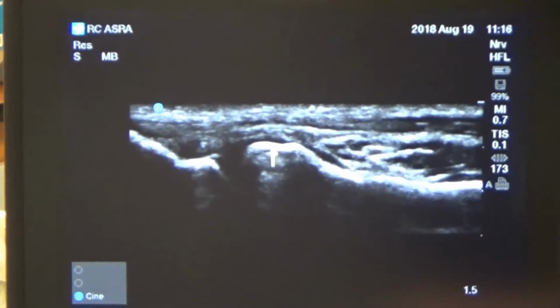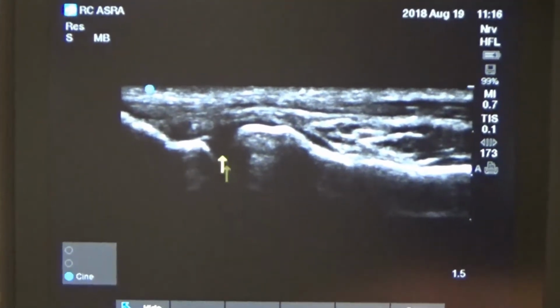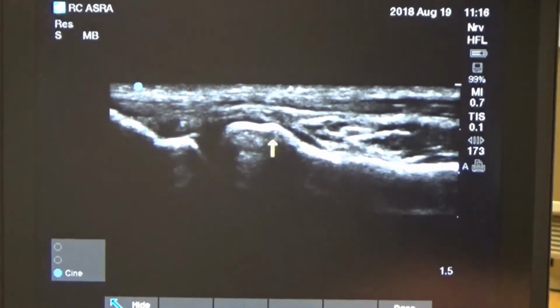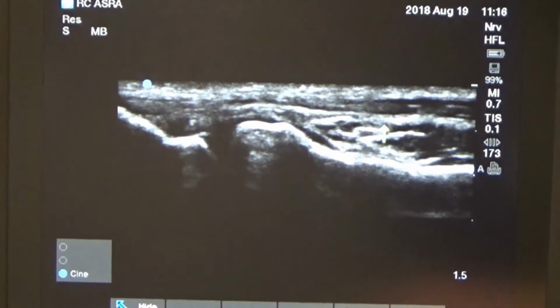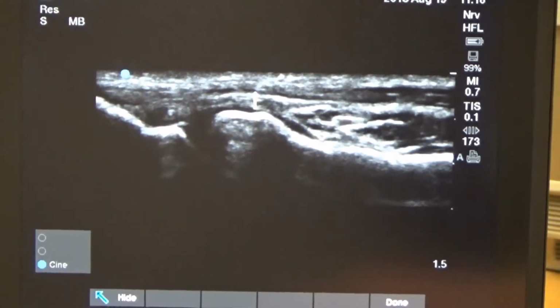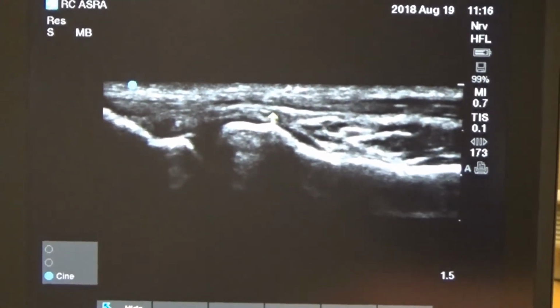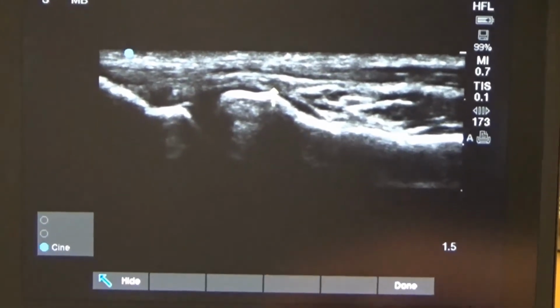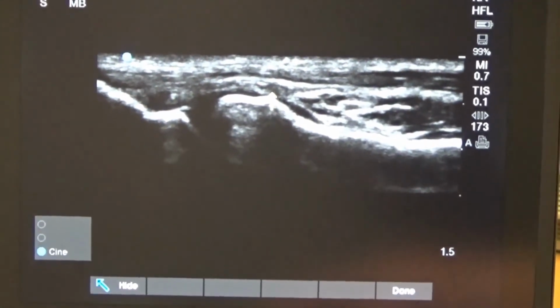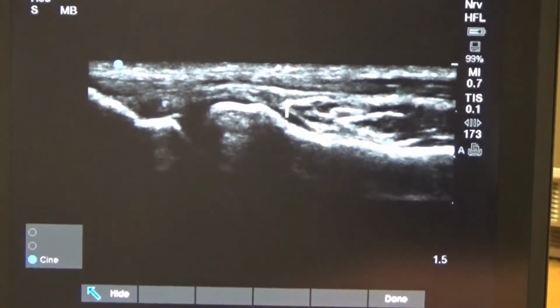It's the lateral epicondyle, and this is the joint itself. And you'll notice some tendinous structures here inserting on the lateral epicondyle. And this actually is our target spot. So when we do the fenestration, we will typically use a small needle.